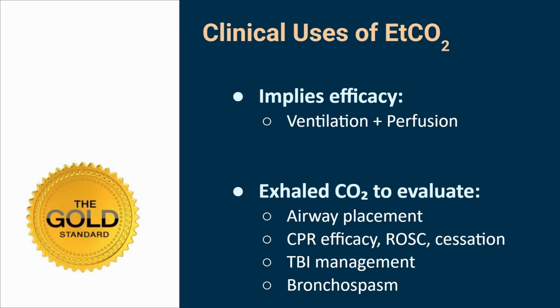I'll never forget putting a nasal intubation in and forgetting to put end tidal on. Earlier in my career, I just forgot. The thing was full of condensation. Condensation doesn't come from the stomach, so I was like, we're good. Heart rate got fixed, everything was okay.